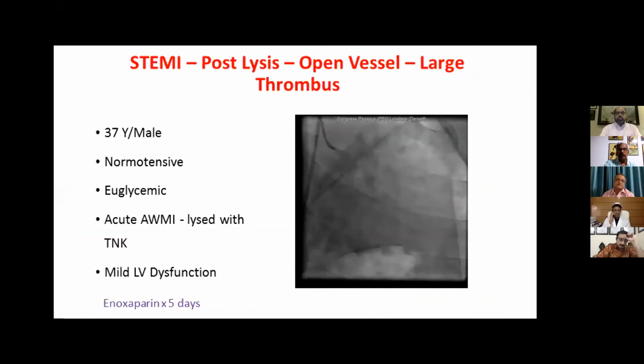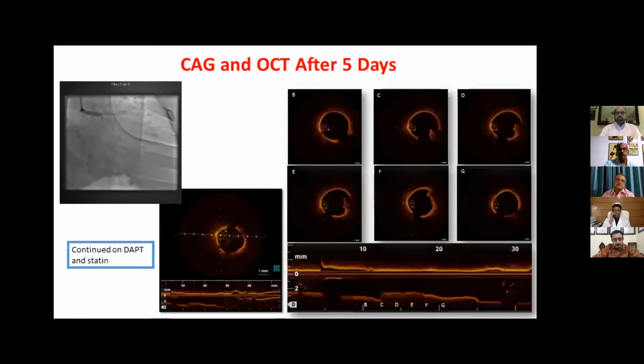There are multiple patients of similar forms, and we just do the same thing. We just do cleaning up of the vessel with thrombus aspiration after an OCT, and then give them dual antiplatelet, bring them back at 48 hours. If still large thrombus, we give them anticoagulation.